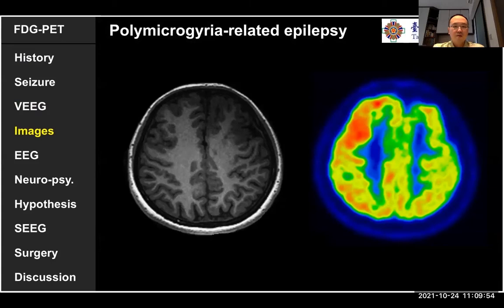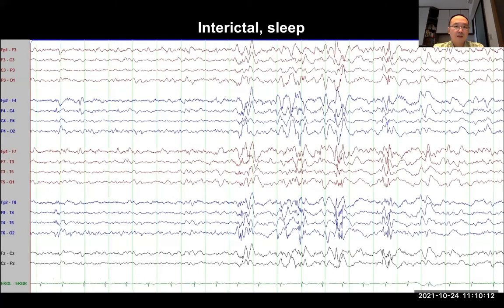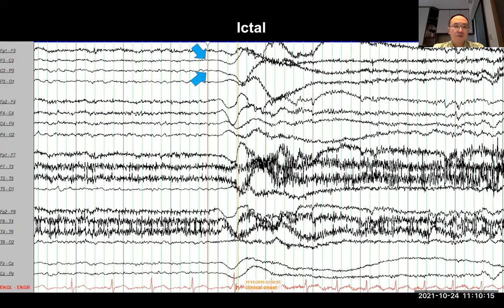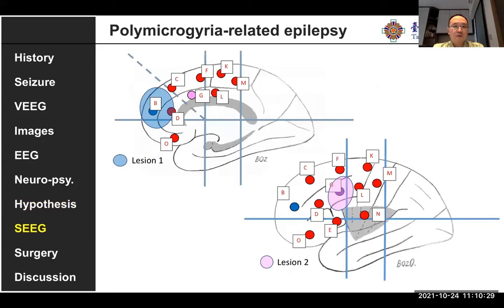You can see a pattern of a little bit of hypometabolism in the two polymicrogyria areas. We need to identify which one has the most significant seizure onset. In the scalp EEG, you can see the most polyspike is coming from the left frontal area, and the ictal onset is much earlier from the left frontal area. So we hypothesize this is a frontomedial seizure with left frontal origin.